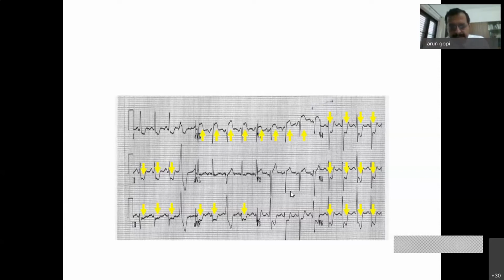If you have an asymmetric T wave inversion with a steeper upslope, a terminal positivity, and a J point depression, this indicates a repolarization abnormality secondary to left ventricular hypertrophy, while an ischemic T wave inversion will be symmetric, will not have a terminal positivity, or will have a corresponding ST segment elevation.